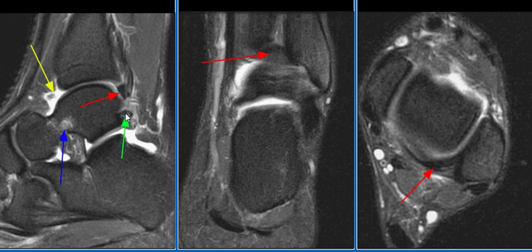Mild proliferative synovitis is seen, as demonstrated on this sagittal image with the yellow arrow.